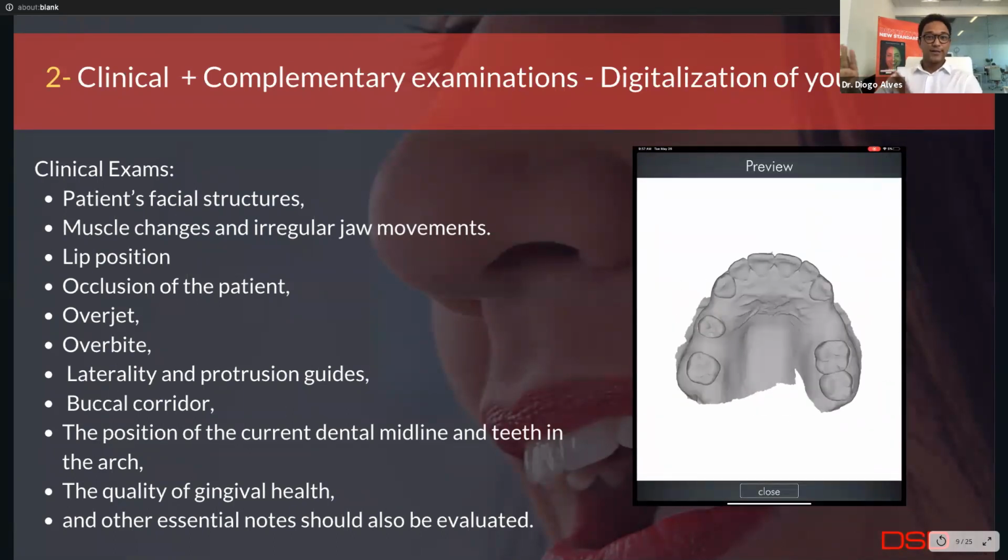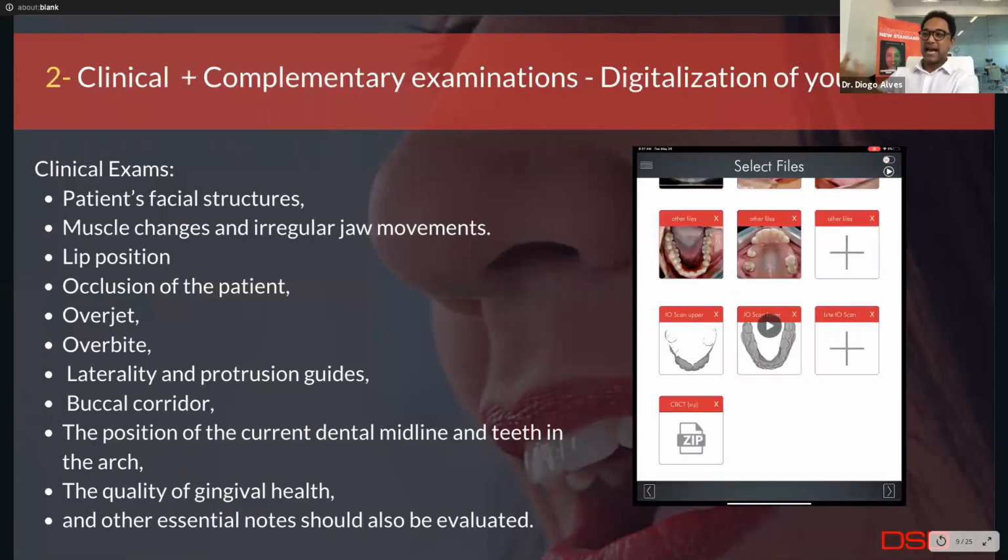And as out of this world that it sounds, this is possible in every office. And we're a very proud company because we are now all over the world, and doctors from all over the world are using this technology and using this workflow, and we're glad that we are able to make more dentists more successful.